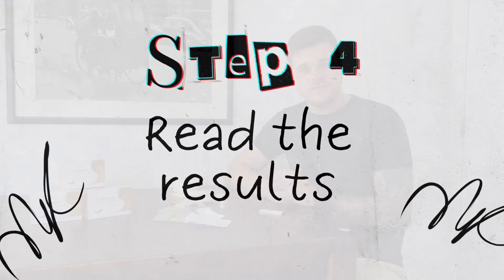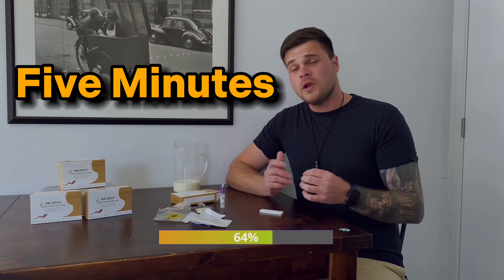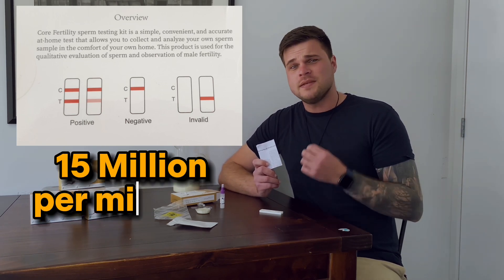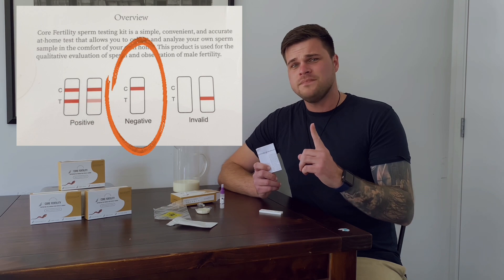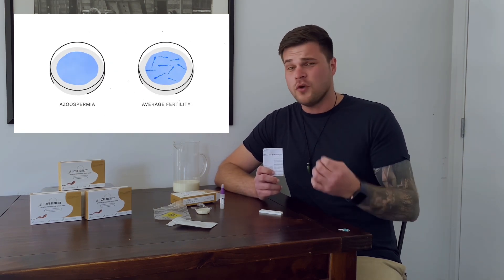Step four: read the results. You now need to wait five minutes before you'll be able to see the results. A red line will appear on the test pad when it's ready. Compare this line to the reference chart included in your kit. If your sperm concentration is above 15 million per milliliter, you'll see two red lines indicating fertility. If you see only one red line, that means you have less than 15 million active sperm per milliliter. For the most accurate results, we recommend taking three tests. If your test shows low sperm concentration, we recommend consulting a healthcare professional for further guidance.